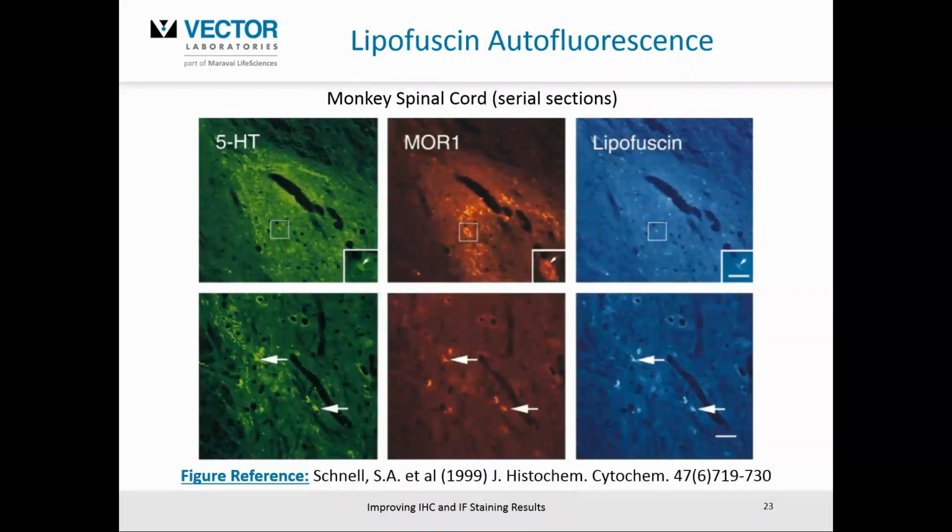There is another source of autofluorescence that investigators face, due to something called lipofuscin. Lipofuscin is really an accumulation of proteins, lipids, etc., predominantly in CNS aged tissue, brain, spinal cord, things like that. It has more of a punctate appearance than what you see with the tissue elements I just showed before.